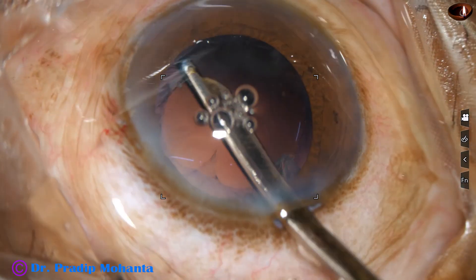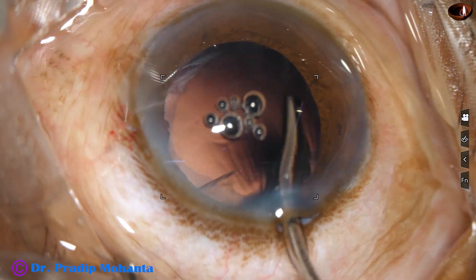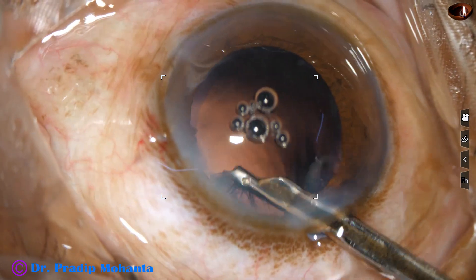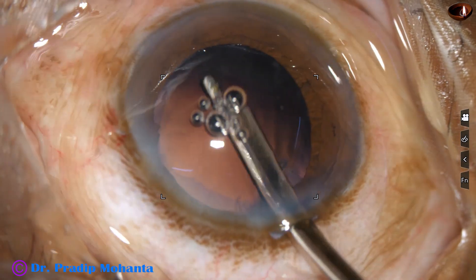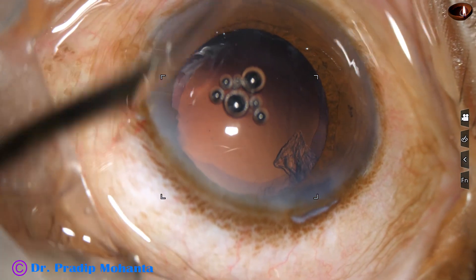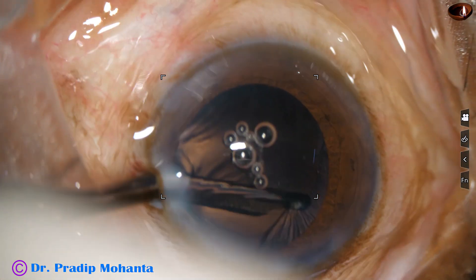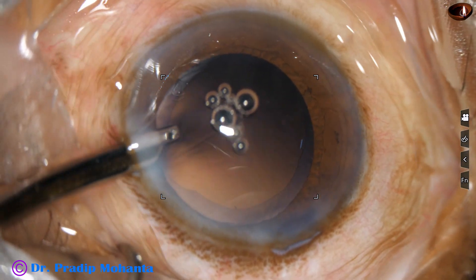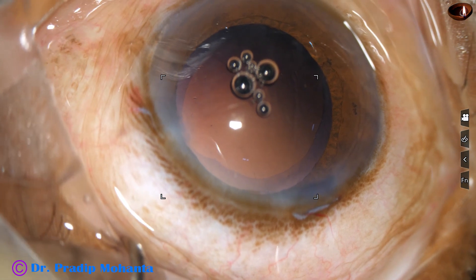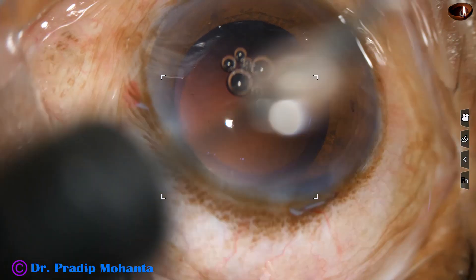I am removing the cortex by a Simcoe cannula. See how beautifully you can remove the cortex by a Simcoe cannula. You cannot use bimanual I/A because there is only one side port. Through the side port, which is about 1.9 mm in size, you can go in and remove the sub-incisional cortex. In this case, the posterior capsule is very clean — there are no cells sticking to the posterior capsule.